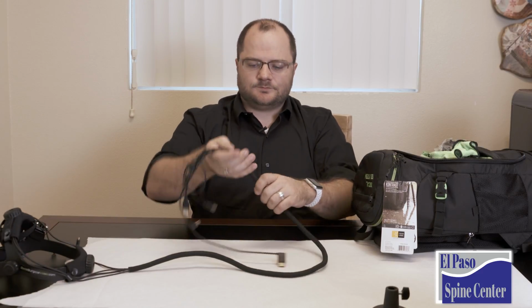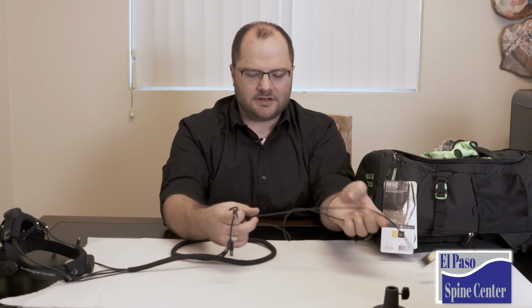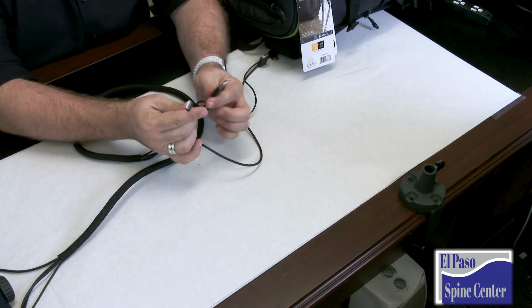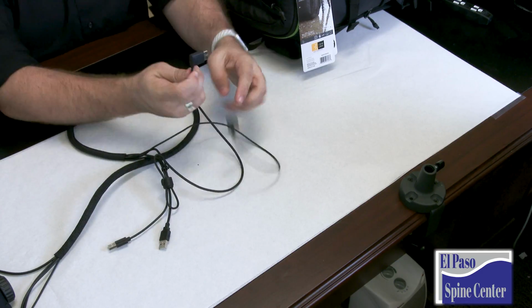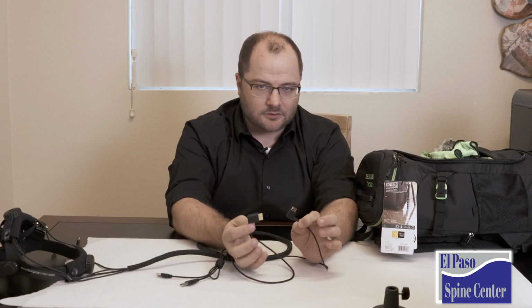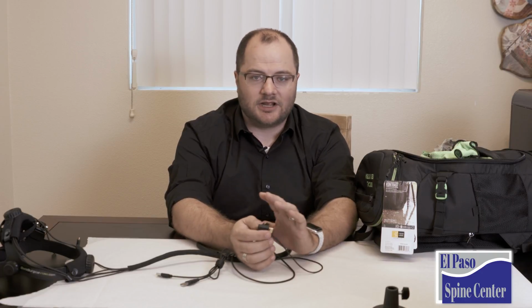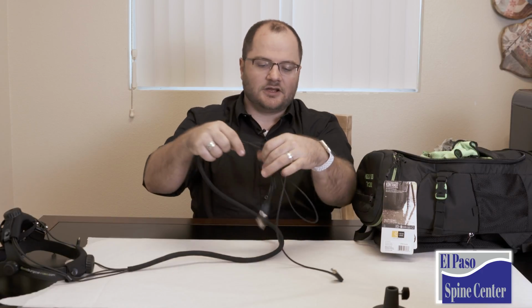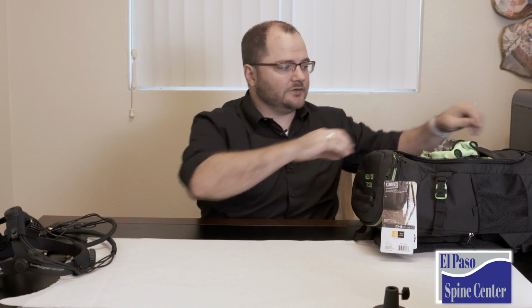These pieces, they all connect through this long cable, and they terminate into two USB plugs, a full-size HDMI, and a mini HDMI. Now, this also threw me for a little bit when I first got the system, but I figured out how it works in order to enable the full wireless capabilities of the system. So before we get into setting up the headgear, let's take a look at the backpack again and talk about that wireless system for a minute.